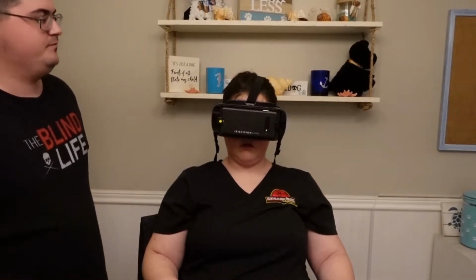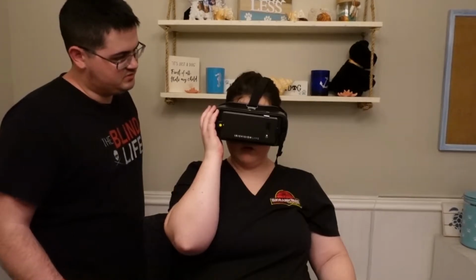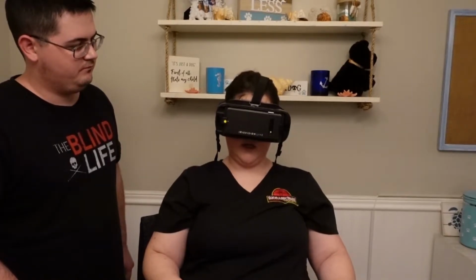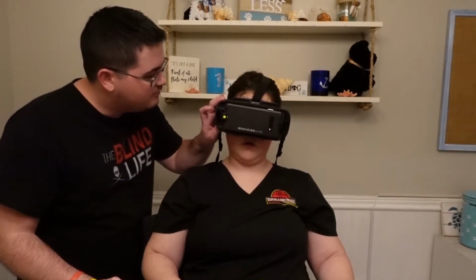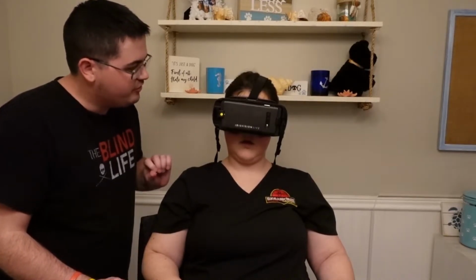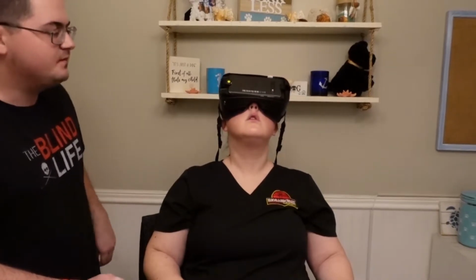So, to move the viewfinder using voice commands, say bottom, to move it to the bottom of the screen. To move to the top, say top. Bottom. Mag bar is set to bottom. Oh, cool. And then, alright, let's try doing it to the top. Top. Mag bar is set to top. There we go. Did it work? Yep. Easy peasy, lemon squeezy.